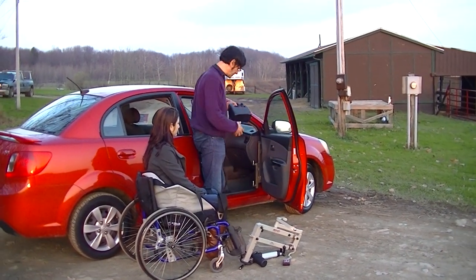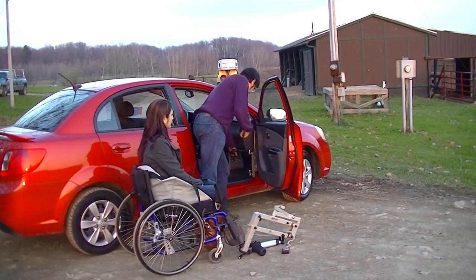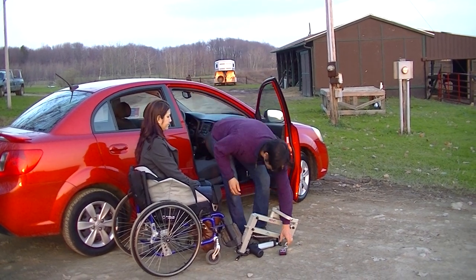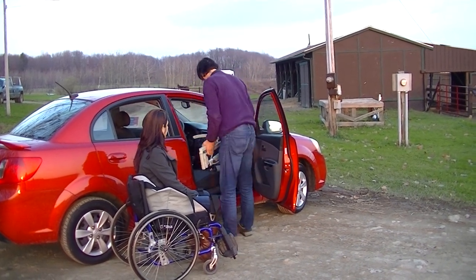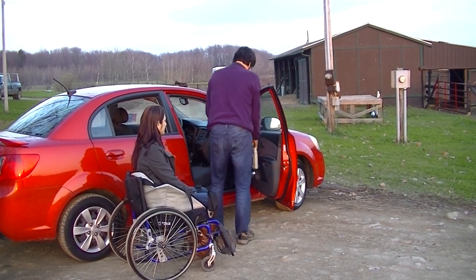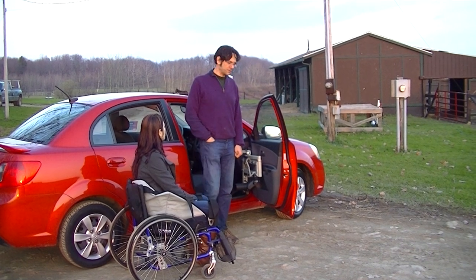We have a battery pack, which is optional, which allows you to power the unit without modifying the vehicle. And last but not least, the Multi-Lift. The Multi-Lift uses a sling, which is already in place here. You can look at other videos on our site to learn how to put that on — it takes about 10 to 15 seconds to put the sling in.